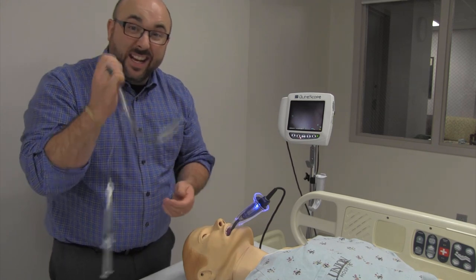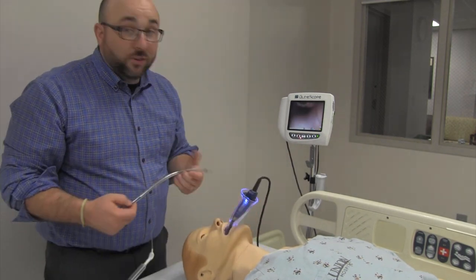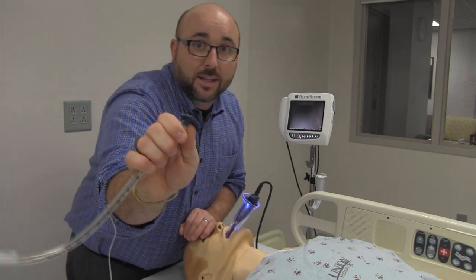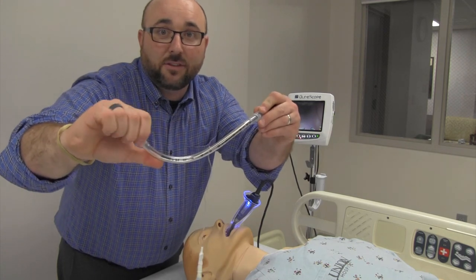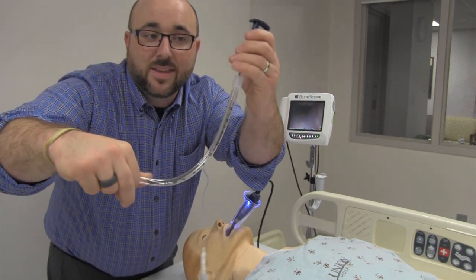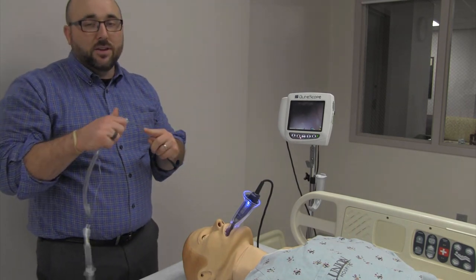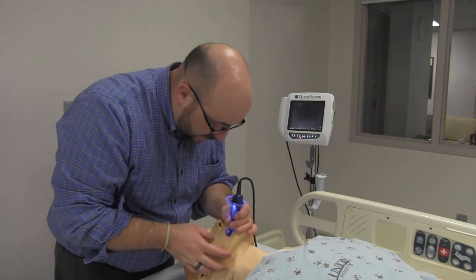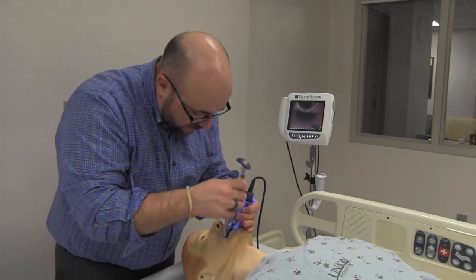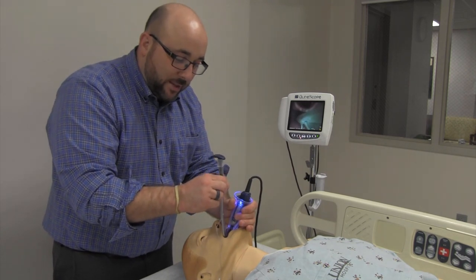Once I get to what we call popping the stylet — you pop the stylet out from a little bit of the tube. What that does is it allows the distal end to bend and flex and go past the vocal cords into the trachea. It's not like direct laryngoscopy where you watch it go straight through and pull the stylet out. There's a lot more finesse. So step three: still watching the mouth, go in from the side, rotate around the corner, still watching the mouth. Once that's done, step four is back at the monitor.